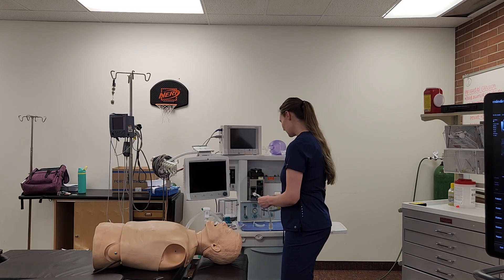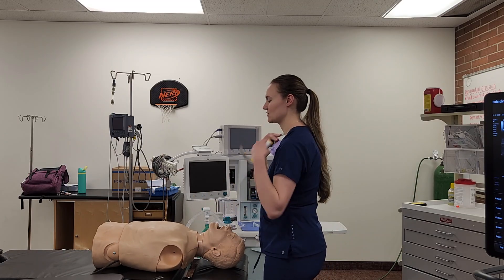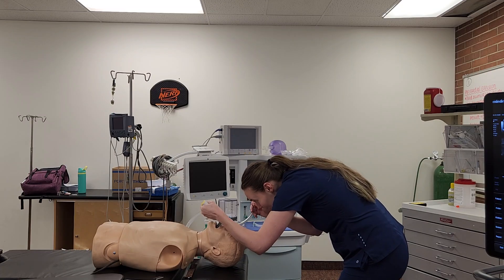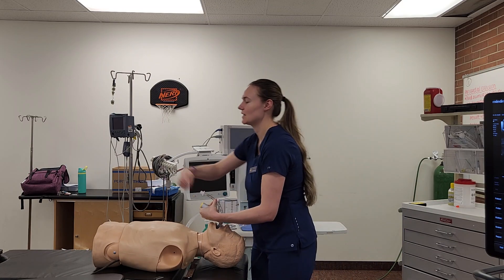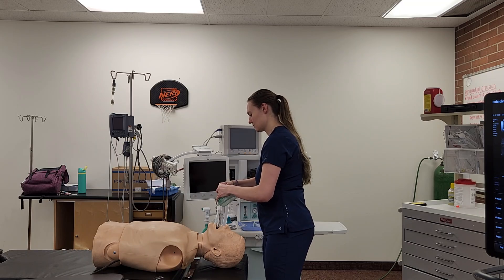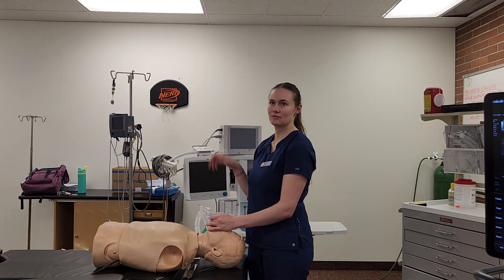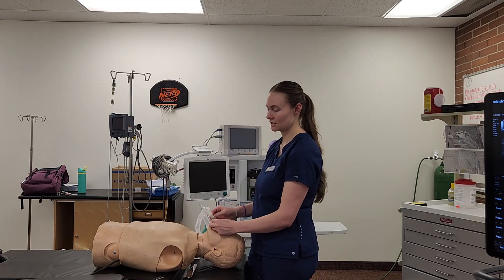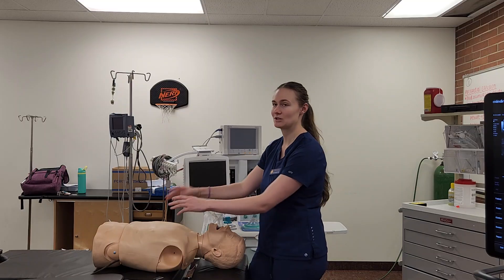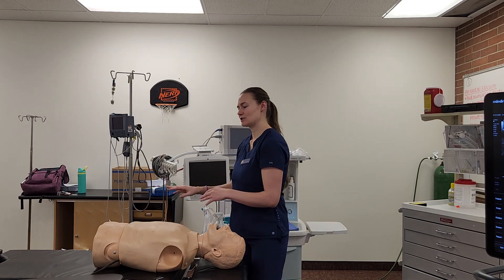Then I'll intubate the patient with my styleted tube, with my circulator standing by for cricoid pressure. I'll open their mouth, ensure good alignment of the airway, visualize the cords, and make sure not to rock back on their teeth. If I can see the cords, I won't need cricoid pressure. My circulator will remove my stylet, and I'll advance the tube through. After that, I'll look at the circuit, check for misting and chest rise, listen for breath sounds, and check my ETCO2. Once I have all confirmations, I'll inflate the cuff and secure it with tape. Then I'll turn on Sevo, reduce oxygen to two liters per minute, confirm loss of consciousness and smooth intubation, make sure they're breathing well, and pad all pressure points for the case.